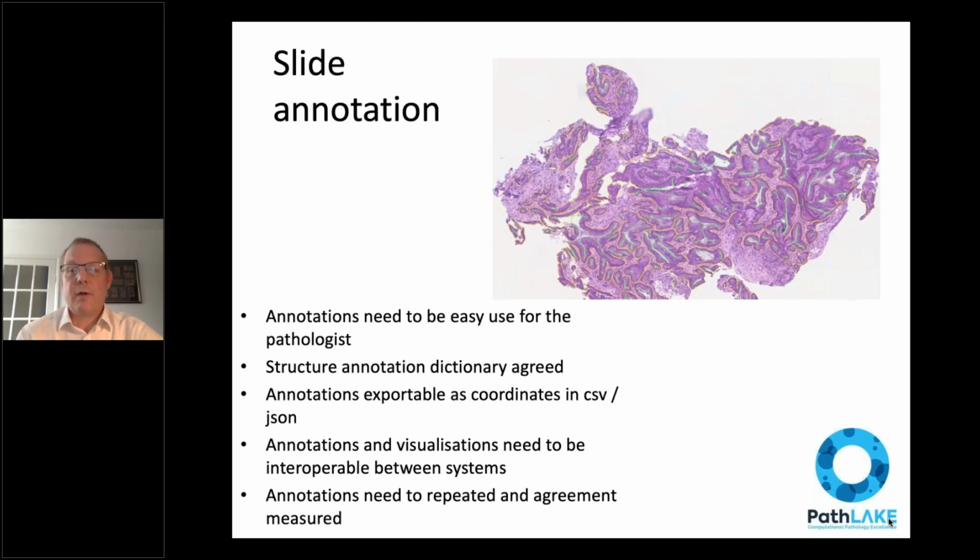And that requires a degree of communication and agreement between different research units and a means, more importantly, of translating differences as and when they've occurred so that they can be catered for as well. However careful you are, you're not going to get this completely right the first time around. It's important to be able to go back and realign things which end up being called slightly differently by different people.